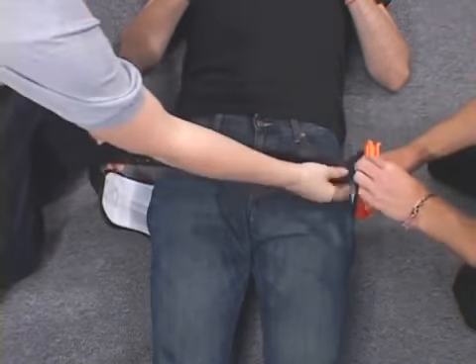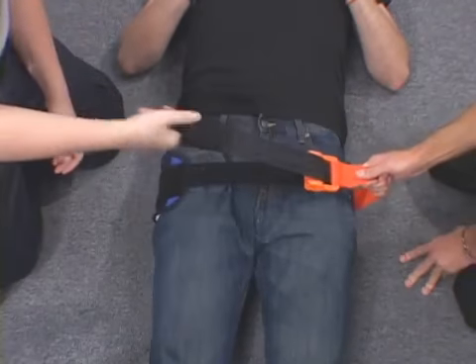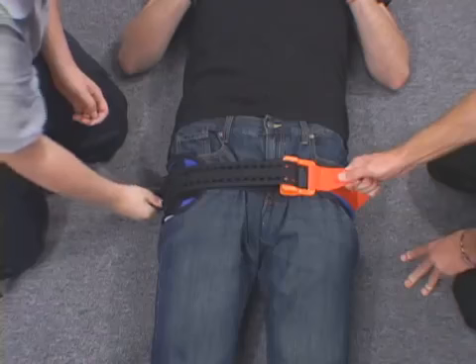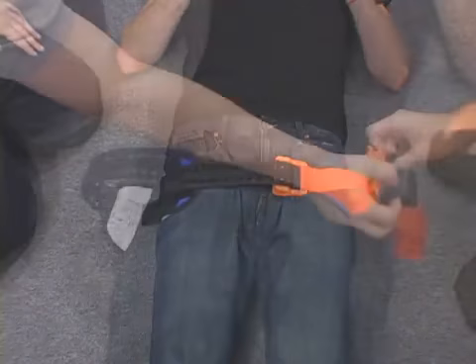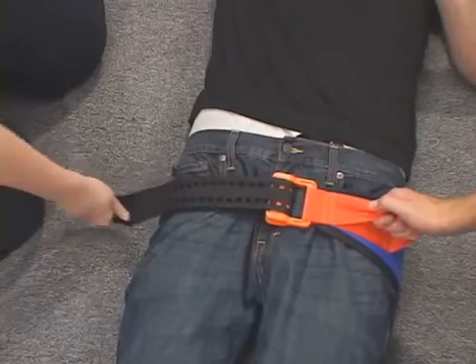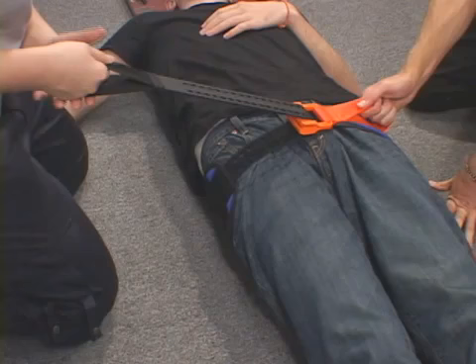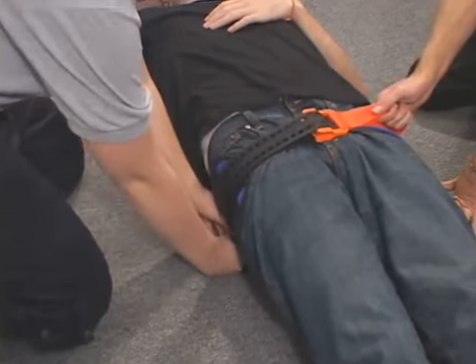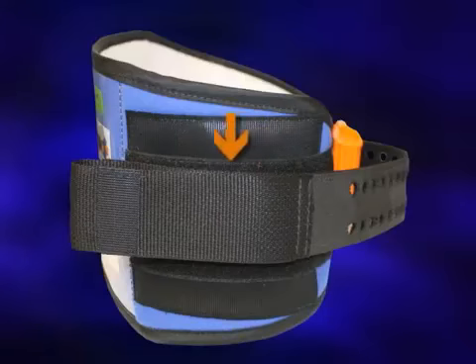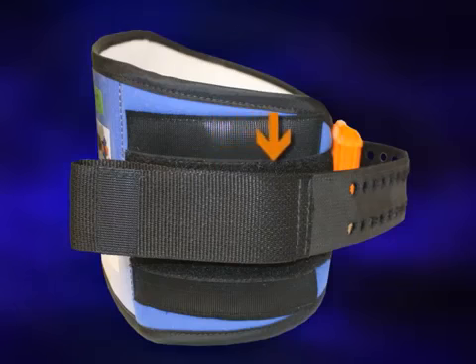Next, insert the webbing through the buckle. Then grasp the fixed pull handle on the other side of the belt and pull the 2 handles in opposite directions. Pull until you feel or hear the buckle click or stop the belt. When you determine that the buckle has engaged, do not release tension. Maintain tension and firmly press the free pull handle against the belt. The Velcro hooks on the surface of the free pull handle will secure it in place.